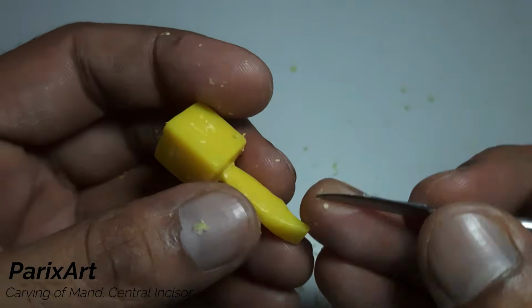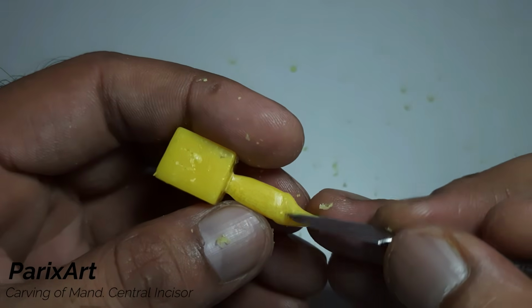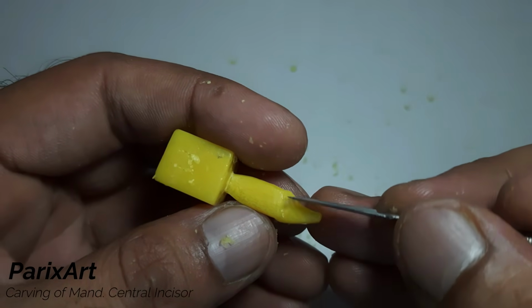Carve the cervical of the crown to get the taper.